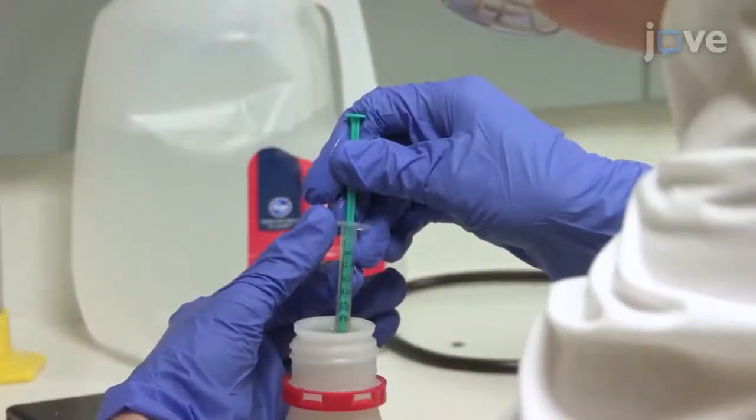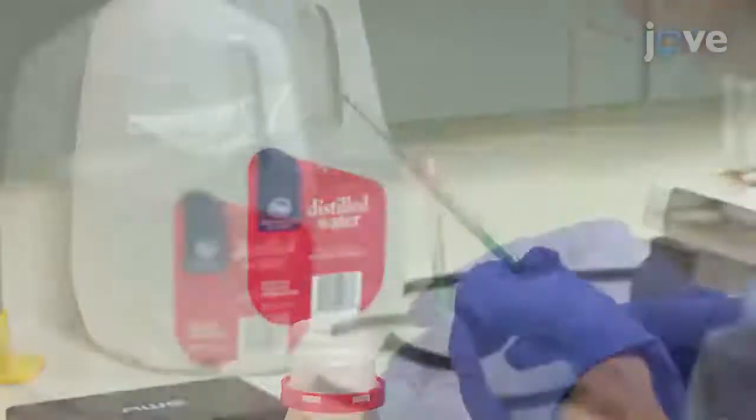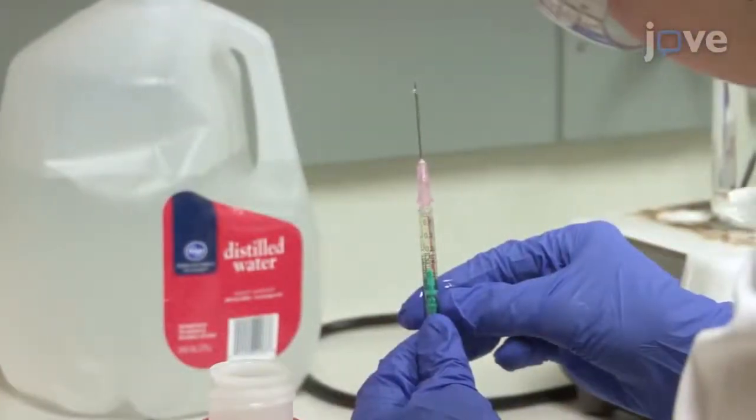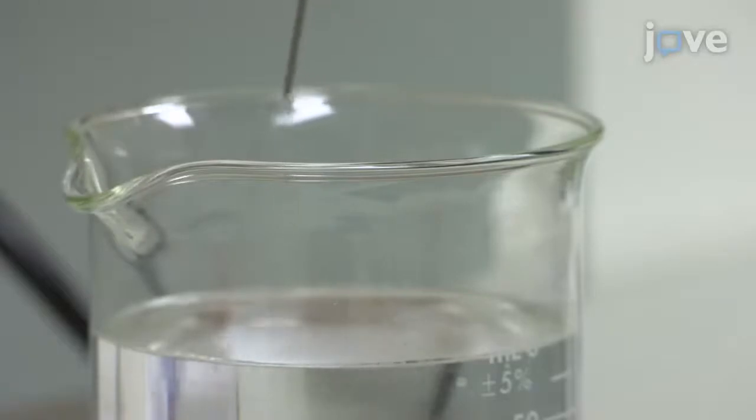Next, use a syringe to measure 0.6 milliliters of the water-soluble surfactant. Make sure there are no air bubbles. Hold the needle a few millimeters over the center of the solution and slowly release the water-soluble surfactant to avoid splatter on the walls of the beaker.